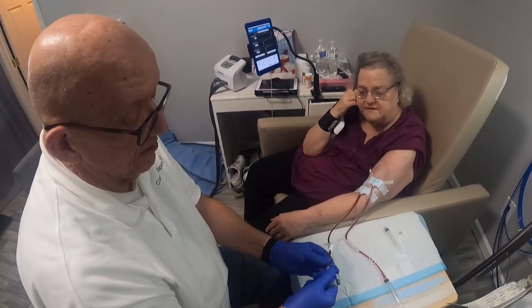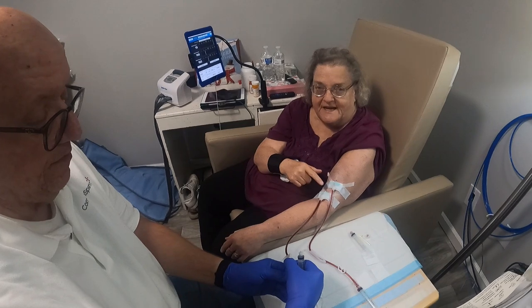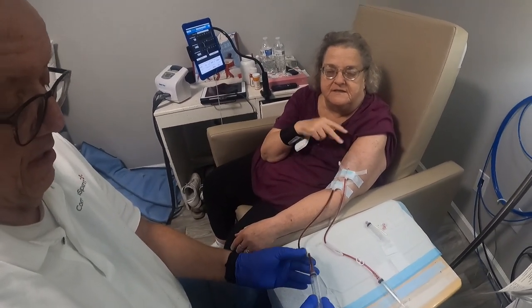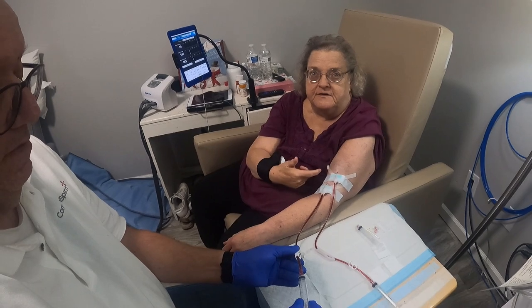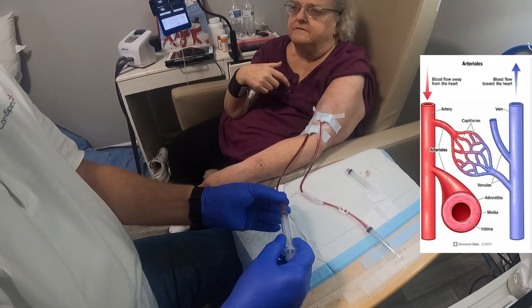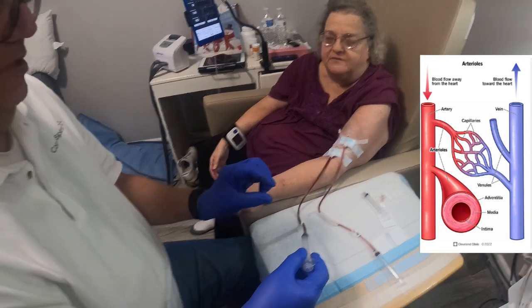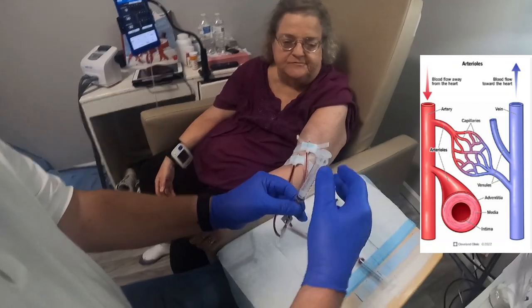Same thing. Can you explain venous and arterial just one more time? The arterial carries the blood out of the body, and the venous is where the blood goes back into the body. It's all one fistula in there, just two locations, in and out. The fistula is a vein and an artery fused together. In your body, your veins carry the blood through the body, and one of them is oxygenating as it's doing the process. So they're both involved. The bright red blood is oxygenated. Mm-hmm. The darker blood is not. Okay. So same thing.